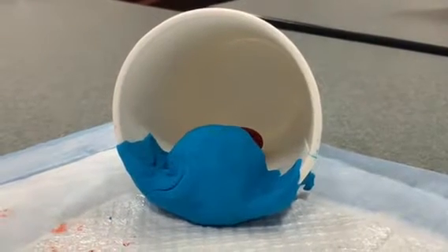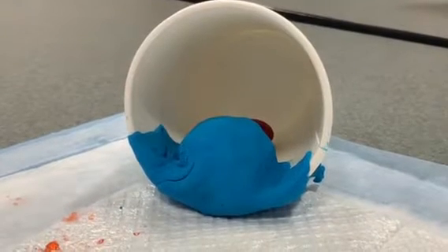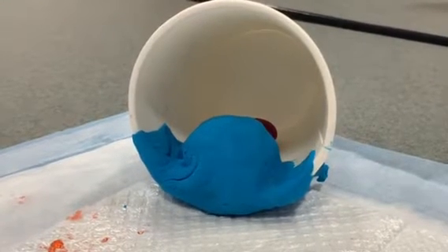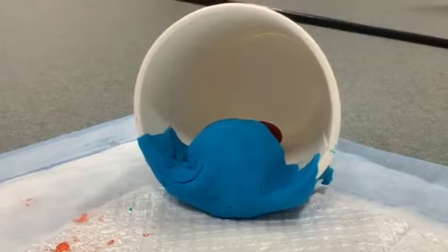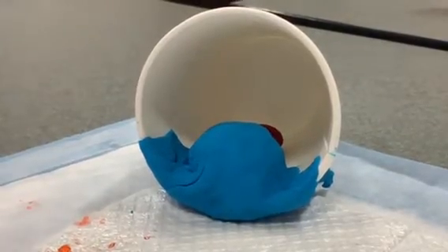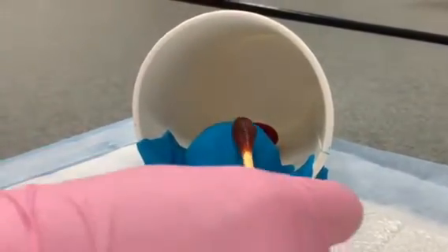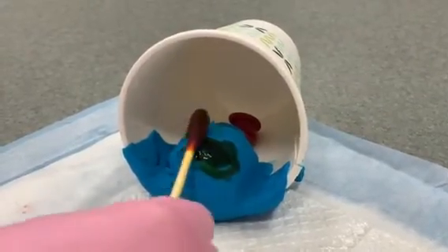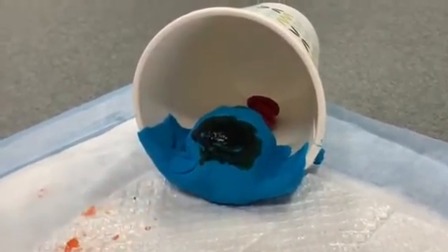We're going to review the steps on how to treat a Bartholin cyst and Bartholin cyst abscess using a Word catheter. First, you prep the area using iodine to sterilize your site. You're going to clean the area where you're going to make the incision, using multiple iodine swabs to sanitize as much of the area as possible.